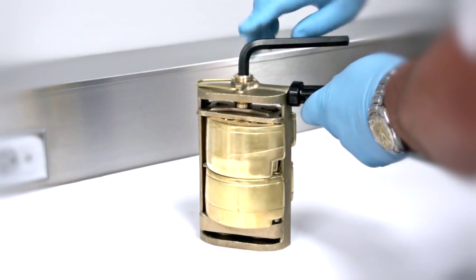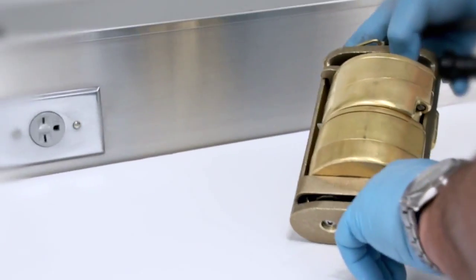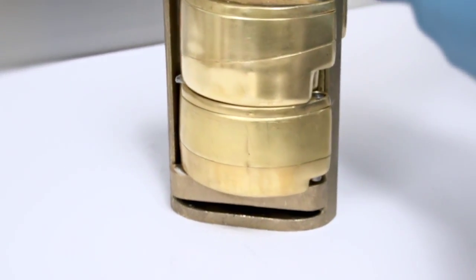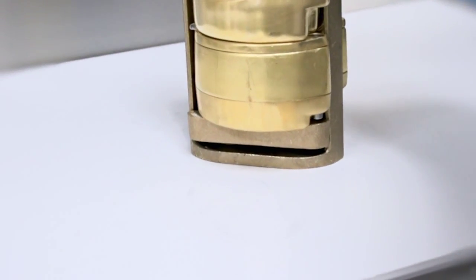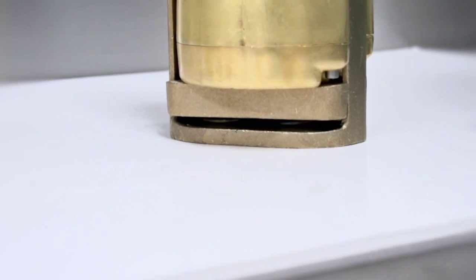Screw it down tight a little bit. This area right down here, we want to make sure that it's not metal to metal. We want to have some room where the flask will be able to expand and contract. It's ready to put in the water bath.